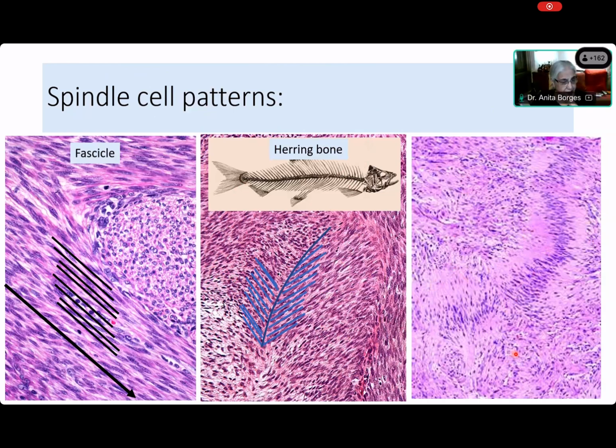All right, so you're having difficulty, Priyamata. All right, let's ask Elsa. So, do you agree it's a fascicle? Palisading pattern. It's a palisade. Okay, so why is it a palisade? She said something about being parallel. Yes, they are parallel. You can see, right? Ma'am, the nuclei are parallel to one another. But why is it then not a fascicle? And the nuclei are perpendicular to its axis. Then the nuclei are arranged, sorry? Perpendicular to the axis. Exactly.